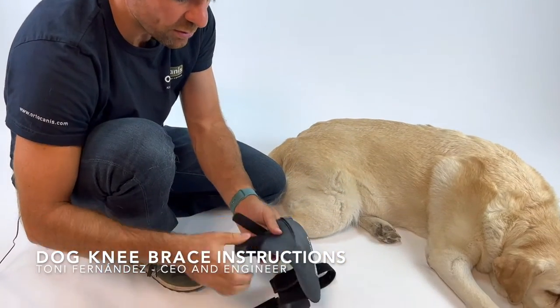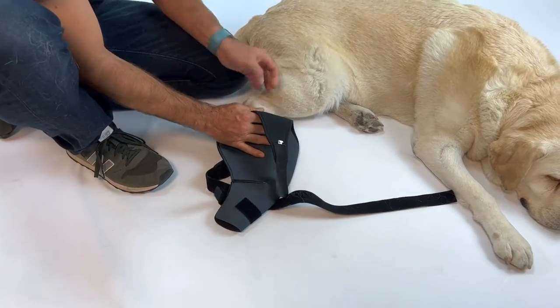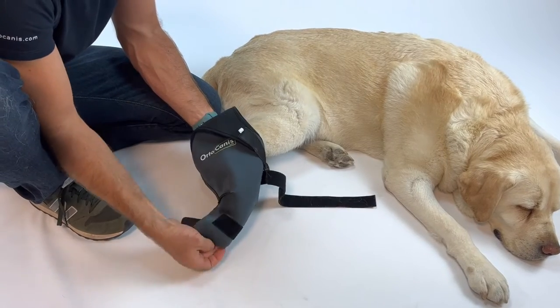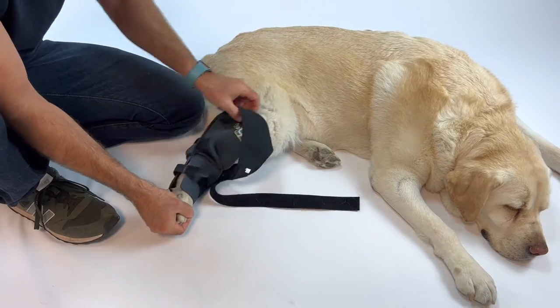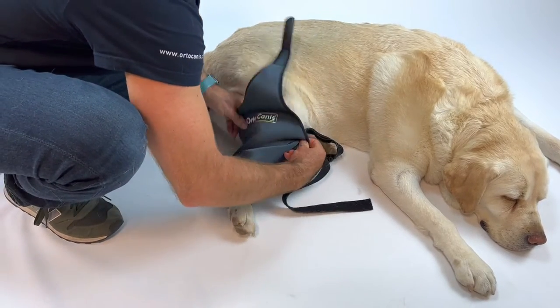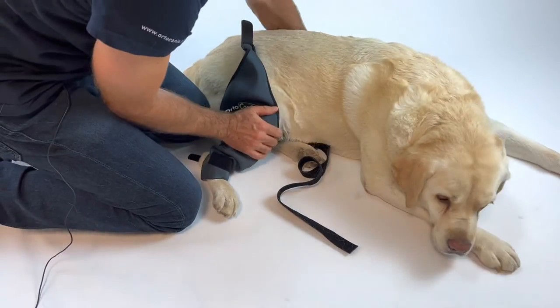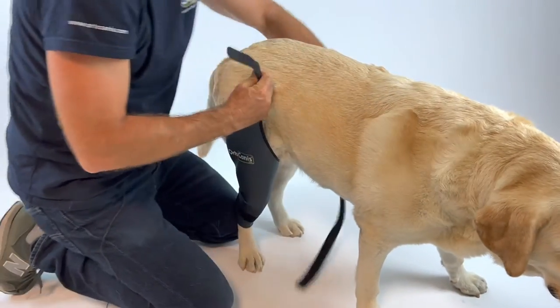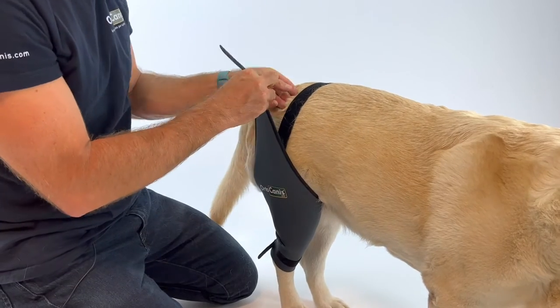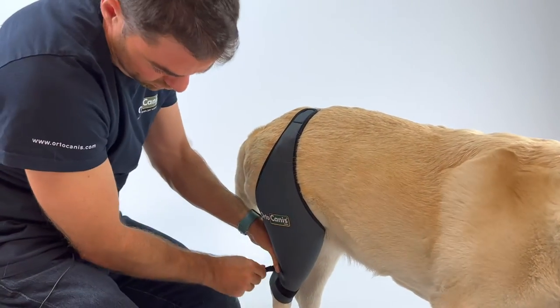Open first the lower strap and introduce softly the leg of the dog on the knee brace. Once we have it, you pull it up. You can cut the extra length of the strap once you finish, and tension it a bit, just a bit. Feel it if it is comfortable and close the lower side.